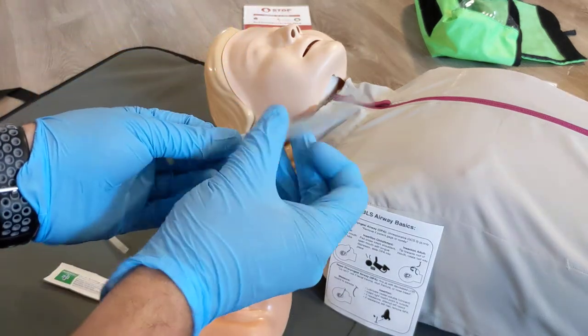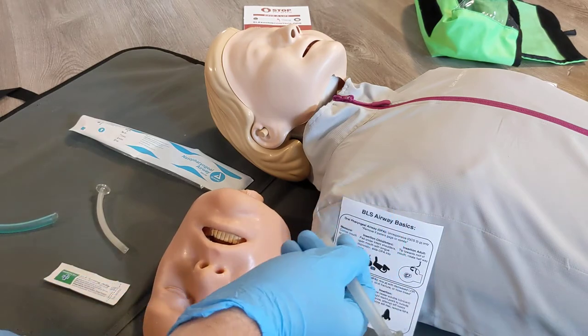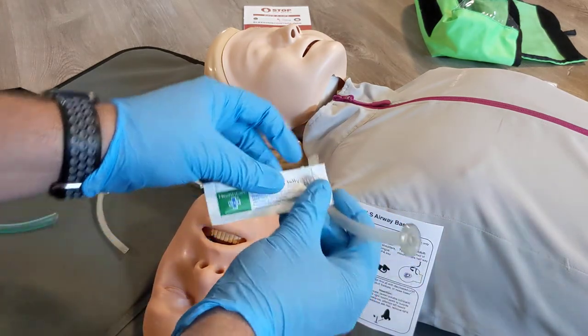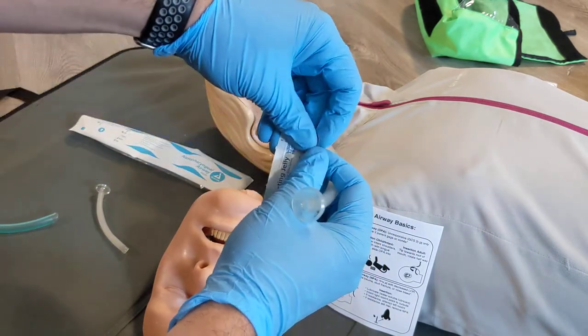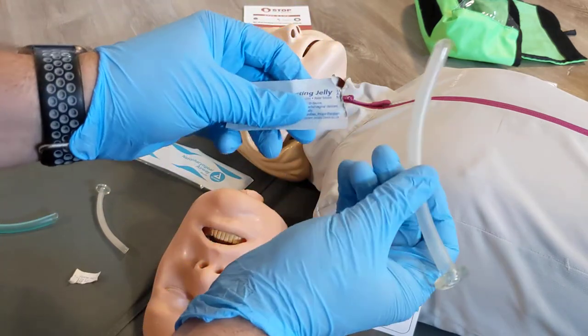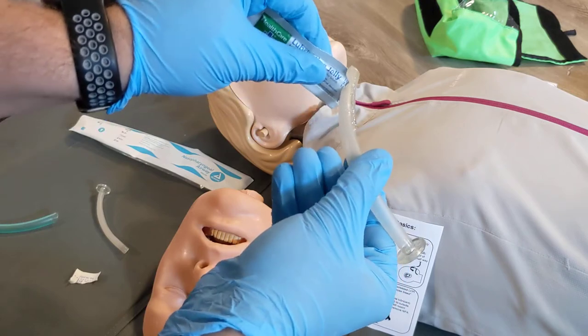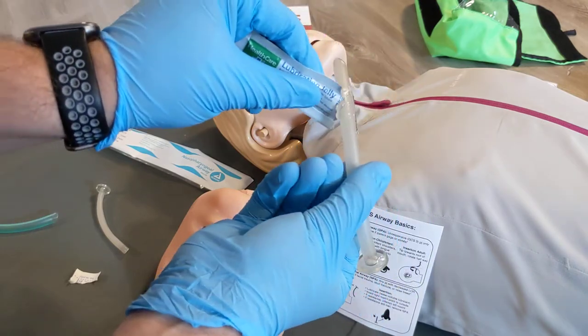These tubes are dry when they come packaged and your nose is generally dry as well, so inserting this dry is not going to work. You need to use a lubricating jelly — specifically for nasal airways or medical purposes. Make sure you're using a lubricating jelly and apply it to the outside of the nasal airway, avoiding getting it actually in the hole of the airway.